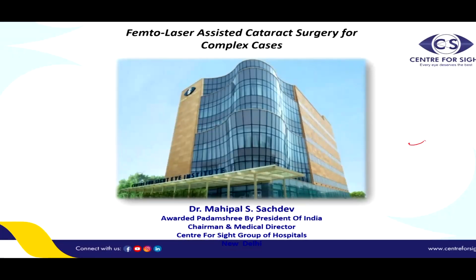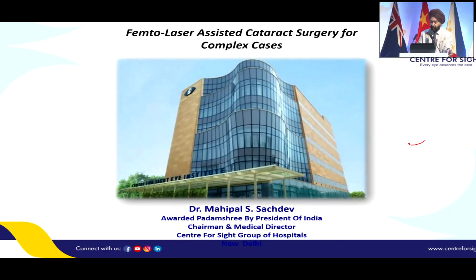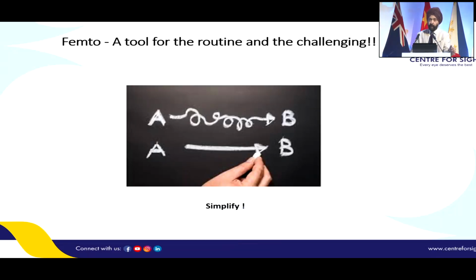So as you all know, femtolaser cataract surgery is the new kid on the block for more than a decade now. And in my personal practice, I do about 80% of my cases through femtolaser assisted cataract surgery. Now, in routine cases, femtolaser cataract surgery obviously has a role, but the role gets exemplified or magnified, as one would wish to say, when you are working in challenging situations.